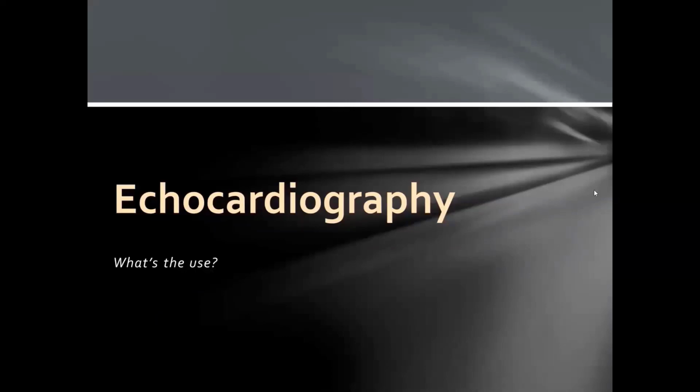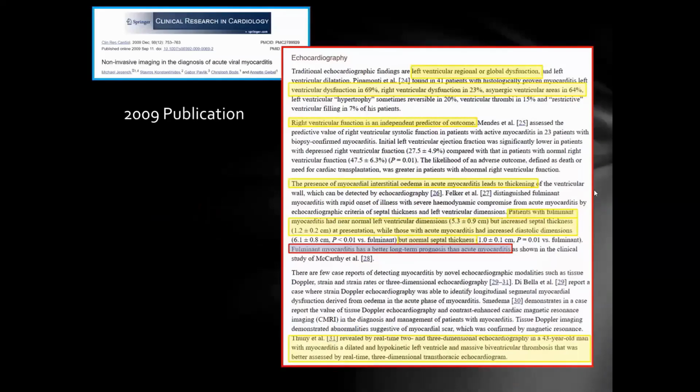So echo, what's the use? So here's a 2009 publication. This was just done in a clinical research journal, 10 years old or so. And there's just some good definitions here as far as where echo's role is.